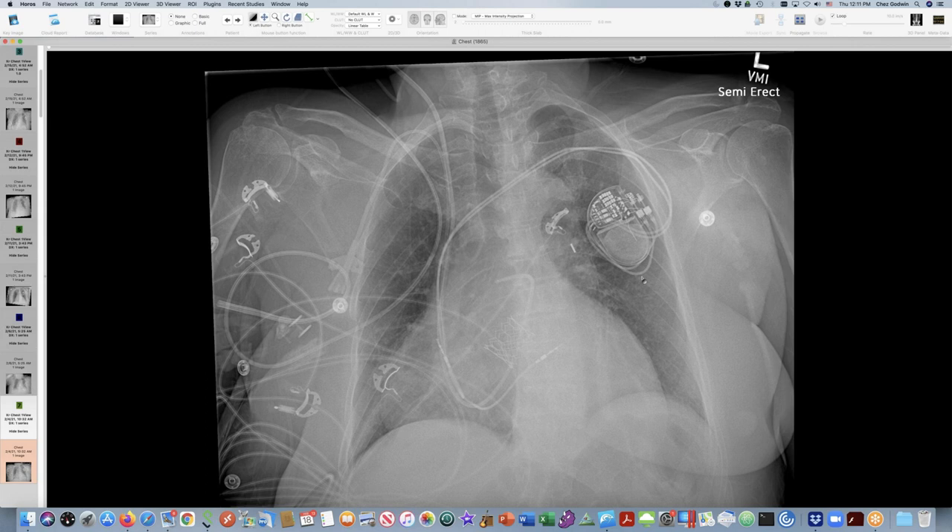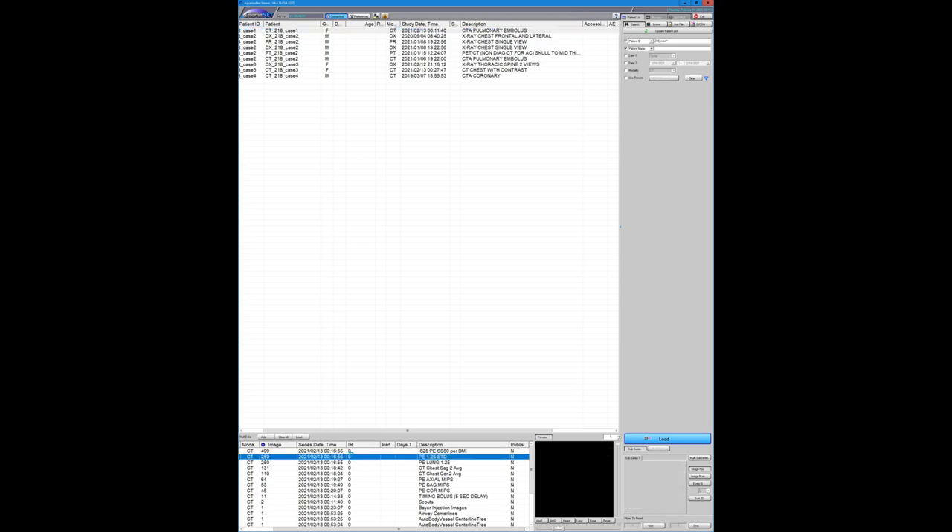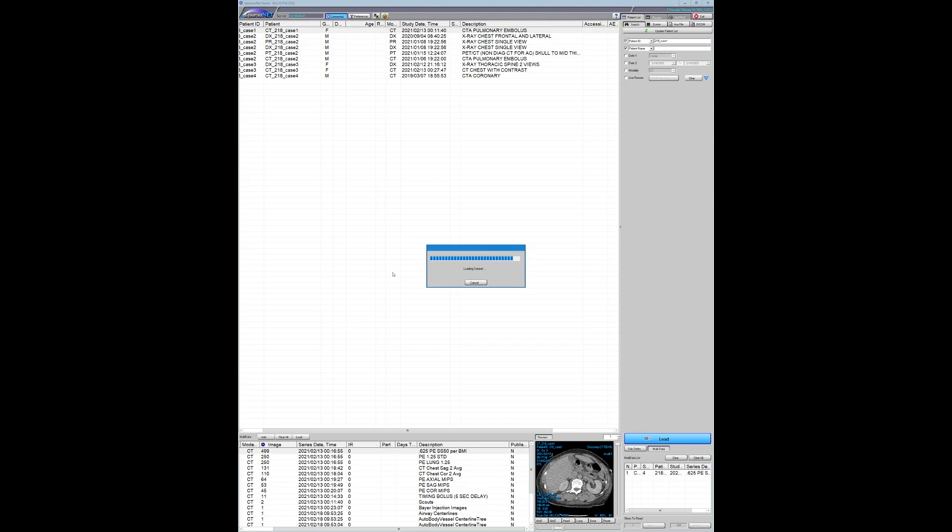Thank you, David. That's very fascinating — I have to keep an eye out for these. All right, Seth, are you ready? So this is a cool case I came across just looking at a pericardial drain. Whenever I see a pericardial drain, I'm always curious what the underlying issue is that led to the pericardial drain. Let me go to thinner slices here.